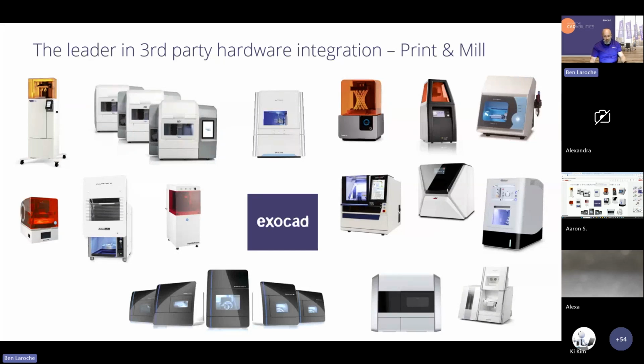It's not supposed to happen during summertime. Once we've talked about all the integration, those are going to be the key components if you're just getting into this: what technology do you want to get, and how does that integrate with all the different pieces you want to get.